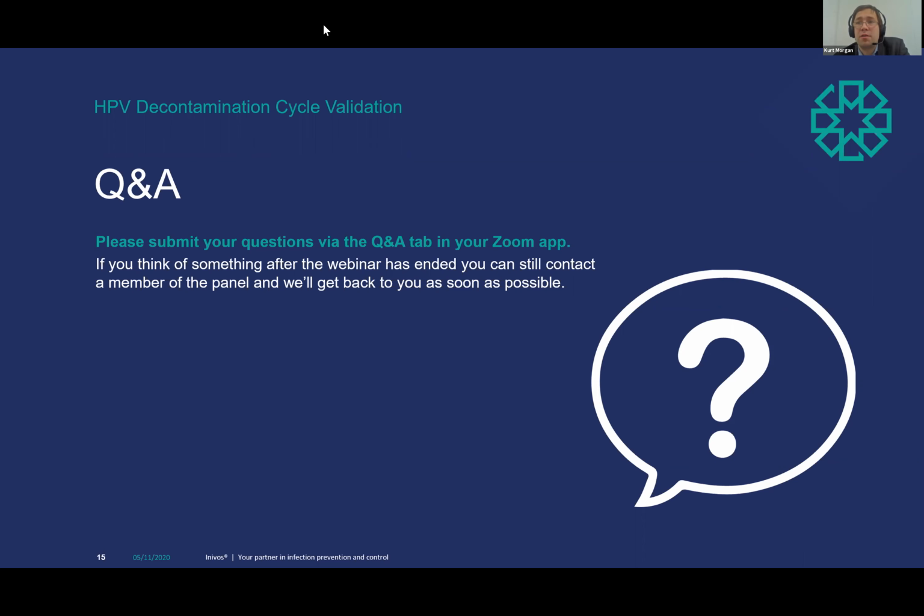We do actually try to notice up front if we're not going to be able to start a process. So in terms of not running a process, hopefully systems might be able to show operators straight away if the conditions aren't going to be met, if the machine needs to be filled up or the room's actually too hot. The machine should be saying that up front, if at all possible, so give people a chance to respond, because the cycles do take a while.